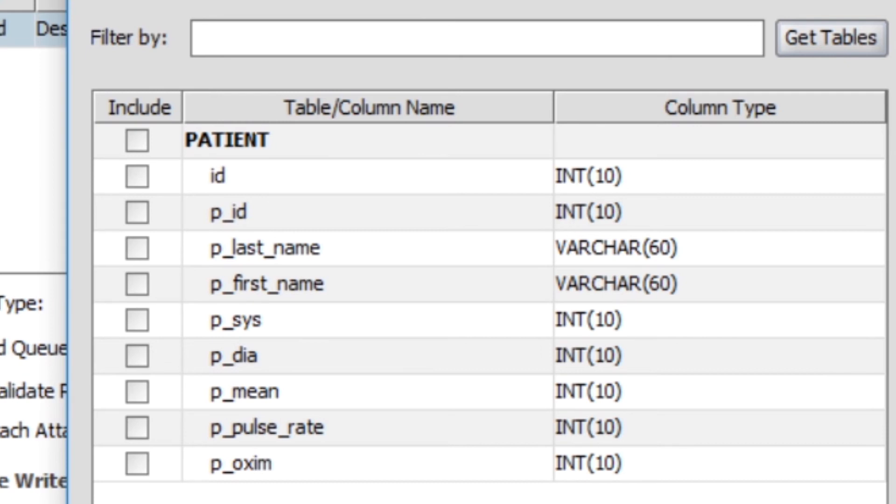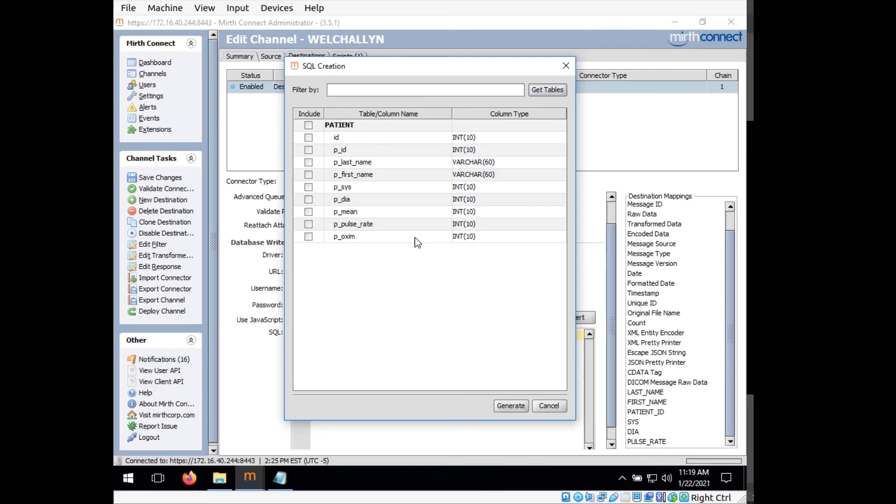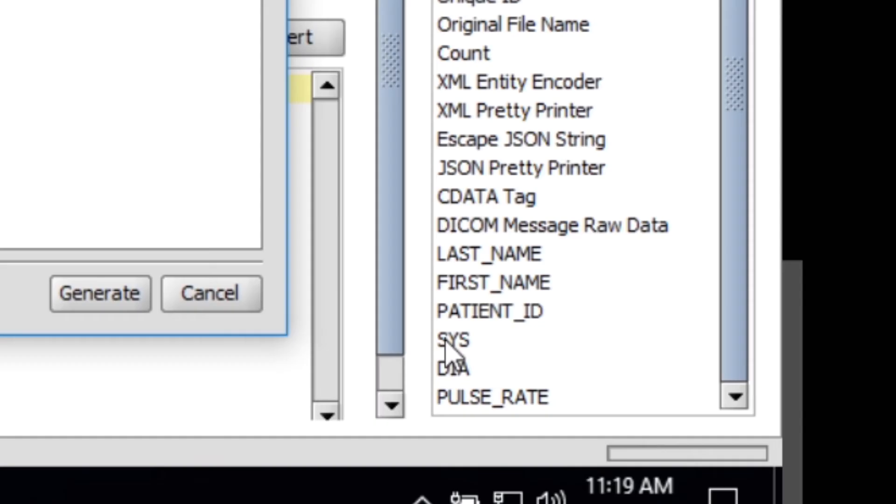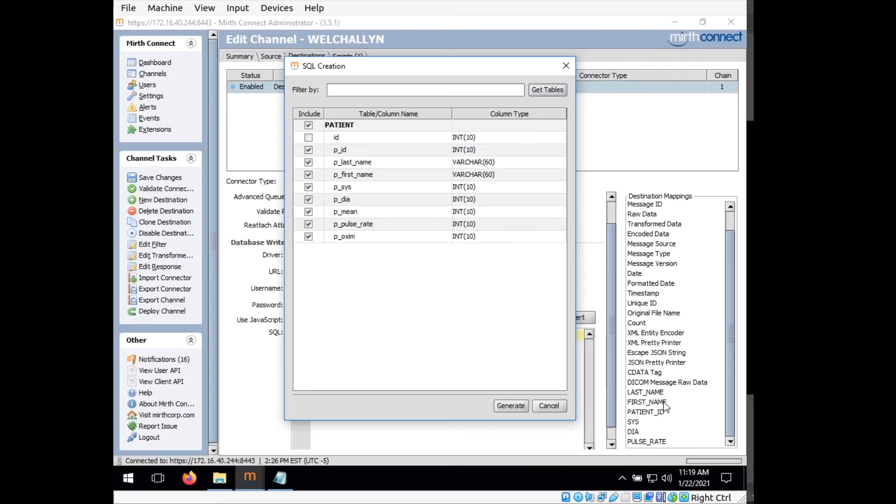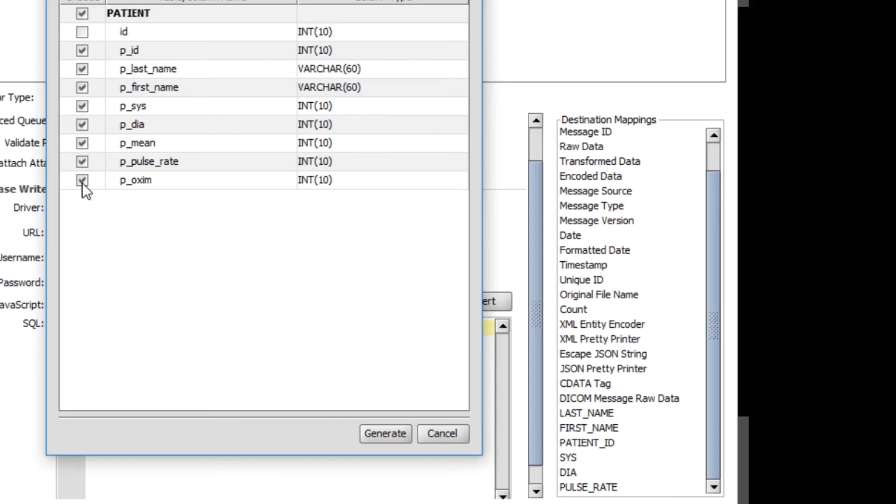So what I'm going to do is select include on patient, but deselect ID. And you can see over here that we have some of these ones in all uppercase. These are the available fields that are present for our device. So we have last name, first name, patient ID, and then three of the vital signs information. So what we want to do is just deselect the ones that are not in that list, so the oximetry, the mean, and pulse rate.